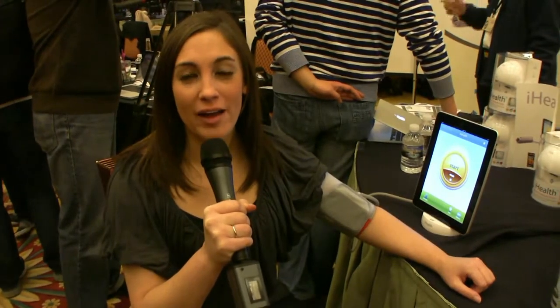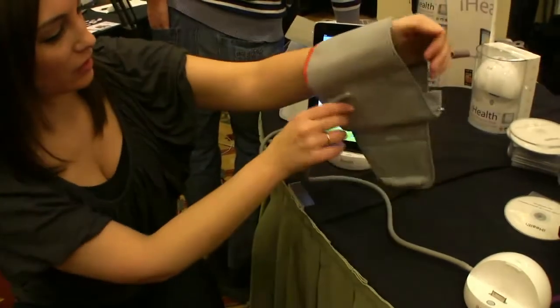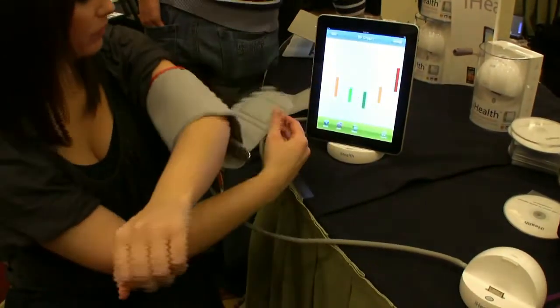This is Kelly Clay from LockerNome and I am testing out the iHealth. The iHealth blood pressure dock is the first ever blood pressure dock that you can use with your iPad, iPod, or iPod touch.